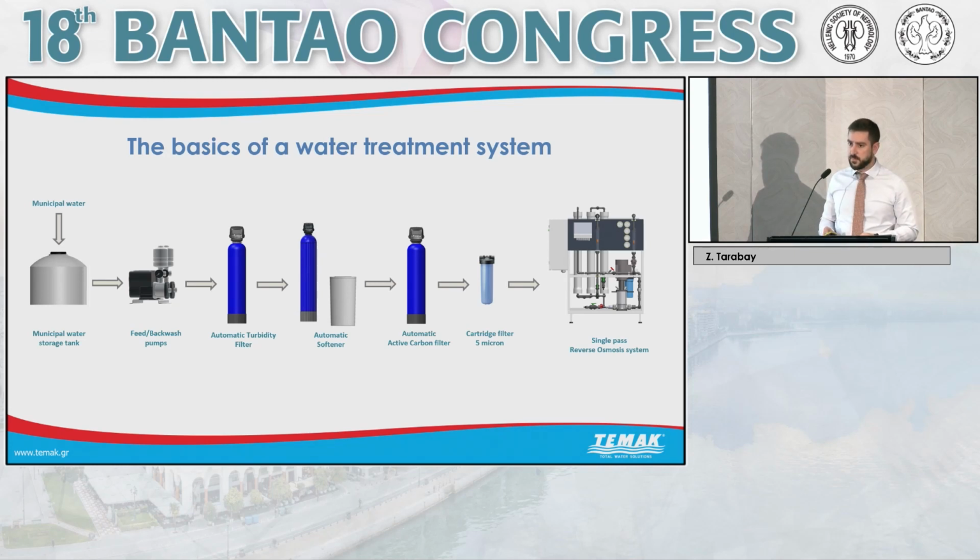In today's presentation, basically, I will present to you the evolution of the water treatment system for hemodialysis, leading up to the most recent designs. And along the way, I will highlight the disadvantage of the older design and the advantage of the newer designs. Before we go into this, though, we have to understand a bit the basics of the water treatment. So as we see here, this consists of the entire system itself.